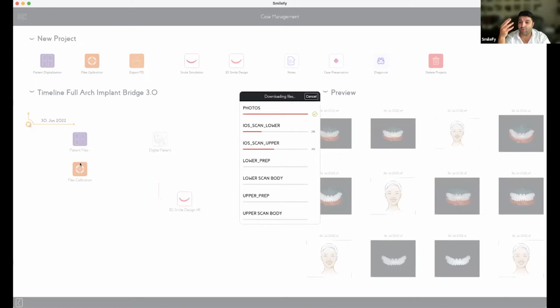We have PIC or iCAM files, 3D files, and we calibrate everything together, and we create the full arch implant bridge based on all the data that we have.